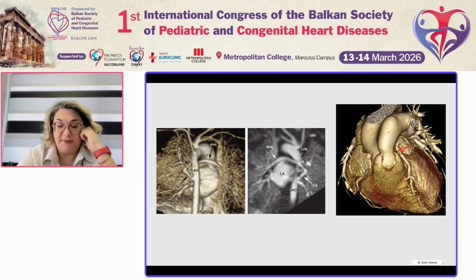Another crucial aspect is coronary artery anatomy, and CMR is also extremely valuable for evaluating the pulmonary arteries and collateral circulation. Three-dimensional angiographic datasets allow comprehensive mapping of the branch pulmonary arteries and the major aortopulmonary collateral arteries, which is fundamental when planning unifocalization procedures and pulmonary artery reconstruction.